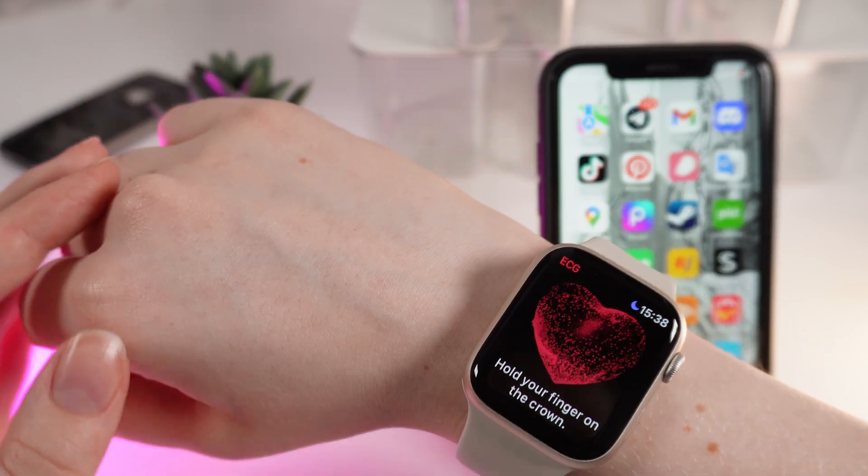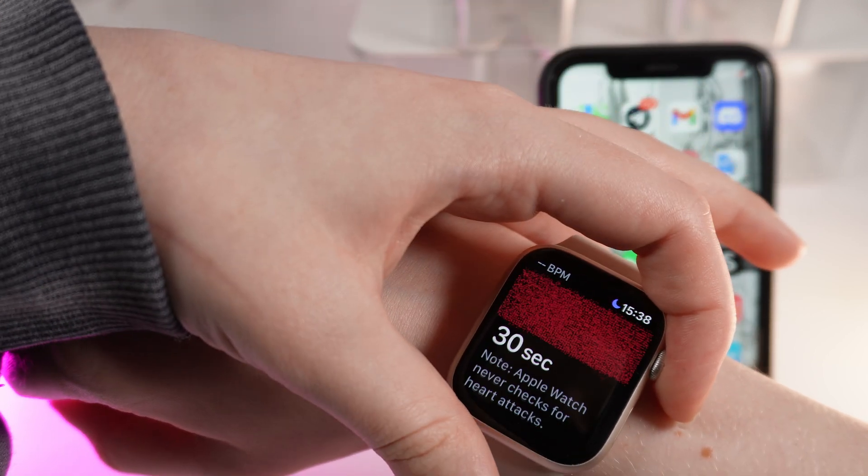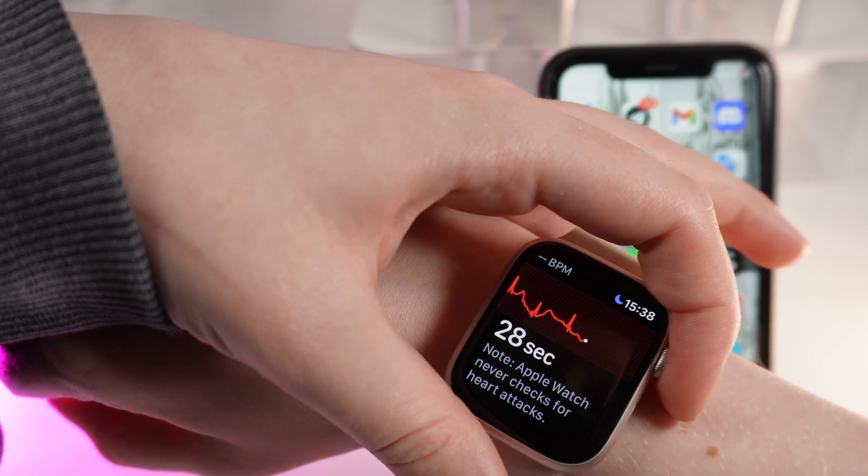To do the ECG measuring, you would need to hold your finger on the digital crown and wait for about 30 seconds.